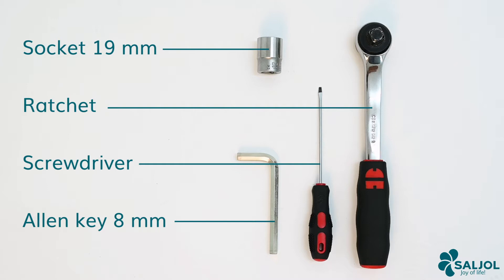For the repair you need a 19mm socket, a large ratchet, a small flat screwdriver, and an 8mm allen key.